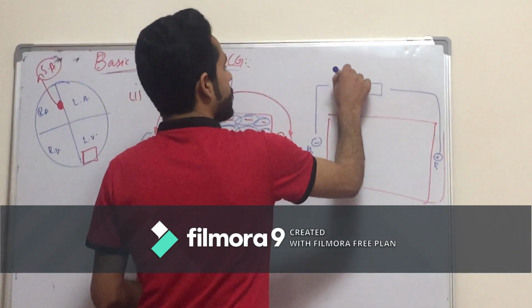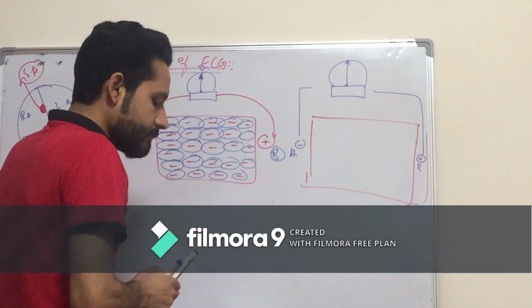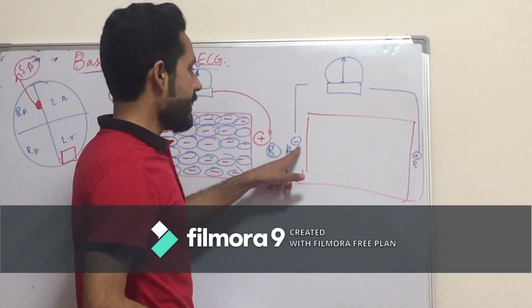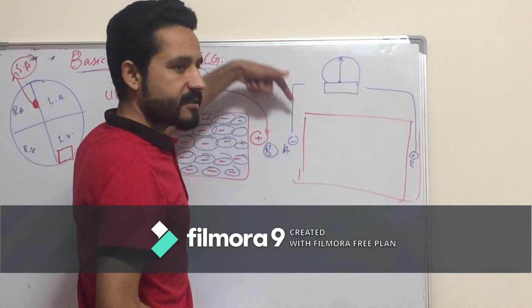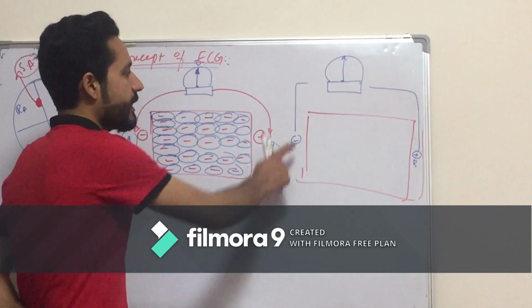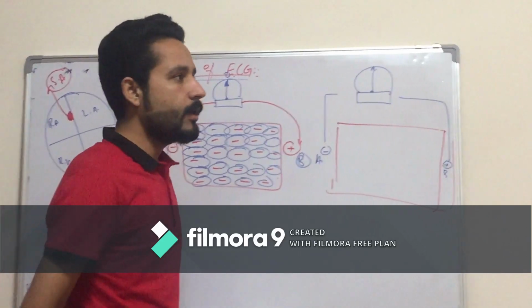This is the galvanometer and this is its needle. Now we will study the case. Suppose this A end is negative and we touch the A end. We can say there is a stimulus at the A end. Obviously when there is a stimulus, there will be a huge influx of positive ions, or sodium ions. And what will happen?